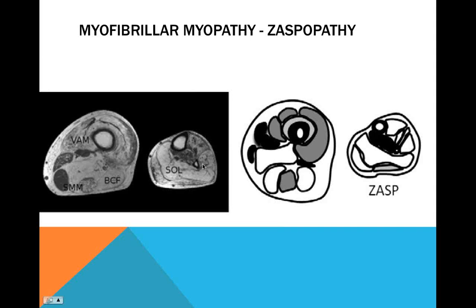Yeah, so that's one of our goals, to correlate what we see on MRI with the motor function testing that we do on all of the patients that come here, and to see if there is a correlation between that. The motor function testing could be either standard PT assessments, or it could be myometry for strength assessments. We're also correlating it to my muscle ultrasound to check the stiffness, where I have that software that checks the stiffness. We're going to correlate the muscle MRI findings to that. So we're trying to see if it actually is something that could be followed over time.